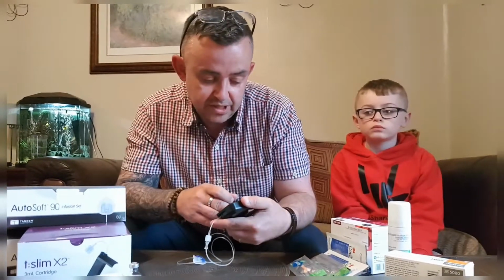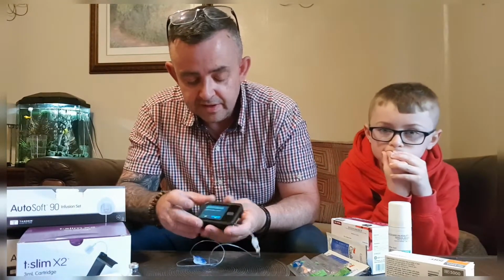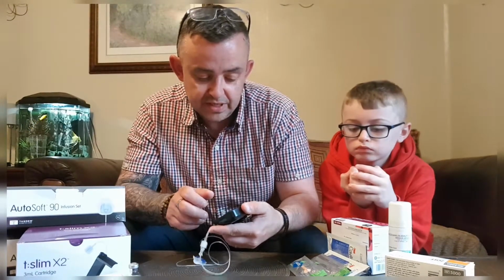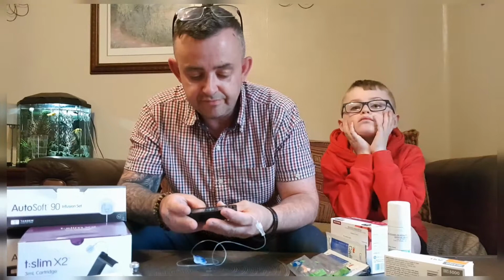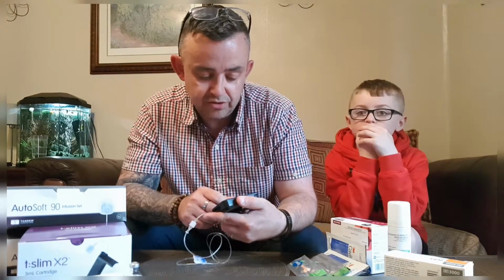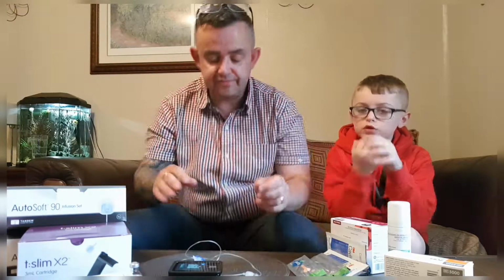that's a warning, change cartridge alert. The cartridge loading process has not been completed. It does that if you leave it a while. Are you ready to continue? Yeah, preparing cartridge. So, remove the cartridge and install a filled cartridge. Tap the unlock button when completed.